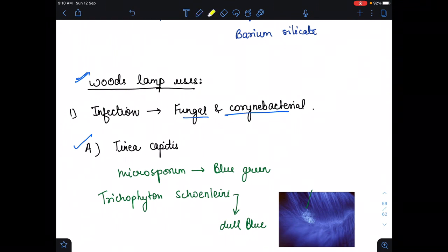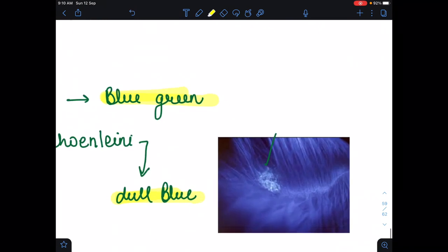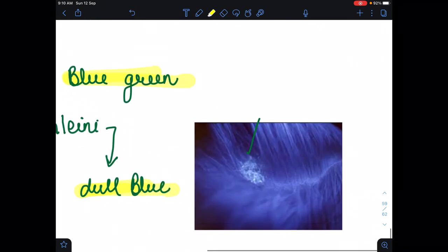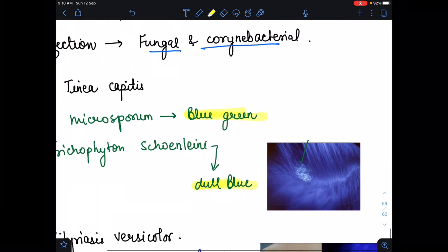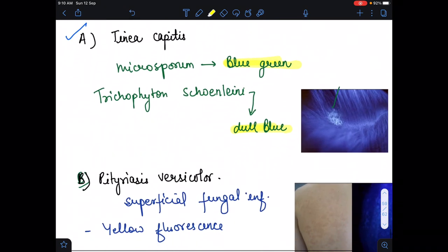The first infection is tinea capitis, in which Microsporum will look blue-green in color, while Trichophyton schoenleinii will look blue in color. In this image of tinea capitis, we see the blue-green color, so it is Microsporum. This is tinea capitis, in which we see Microsporum or Trichophyton schoenleinii.